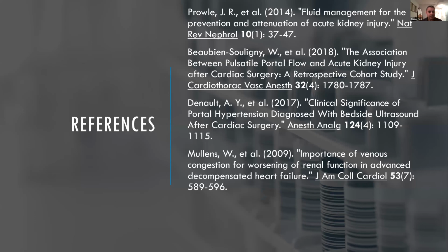If I have someone with a dilated IVC and a portal vein pulsatility, that portal vein pulsatility is going to have lower weight as far as proving cardiorenal syndrome than the renal vein. The renal vein strength would go up more for me. And so if the renal vein is pulsatile, I'm done. I don't even need to look at the portal vein.